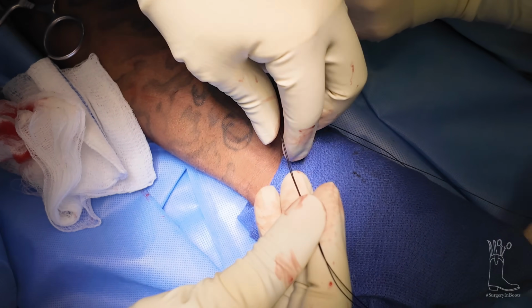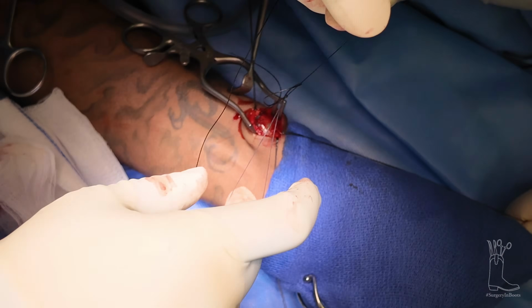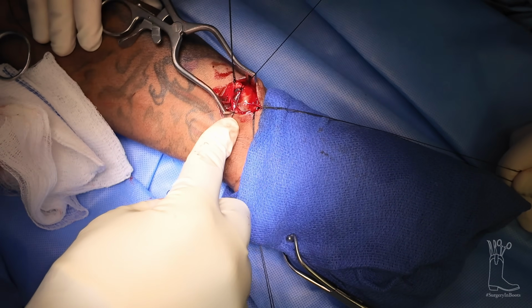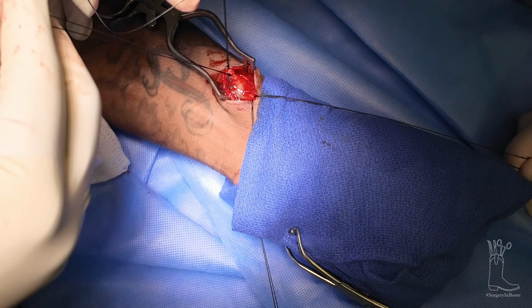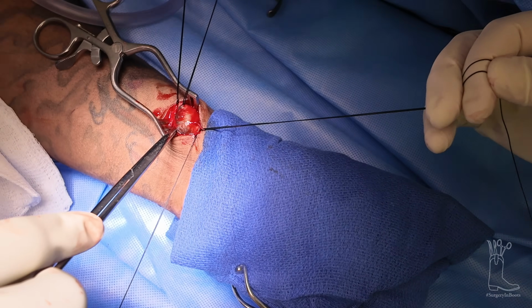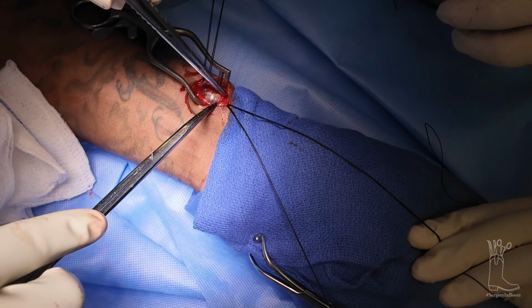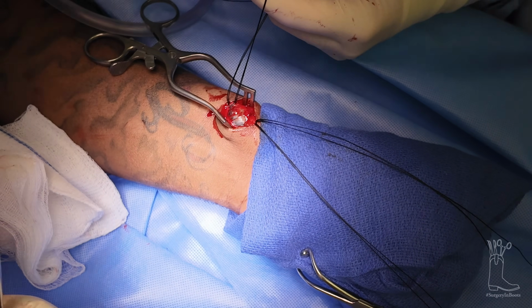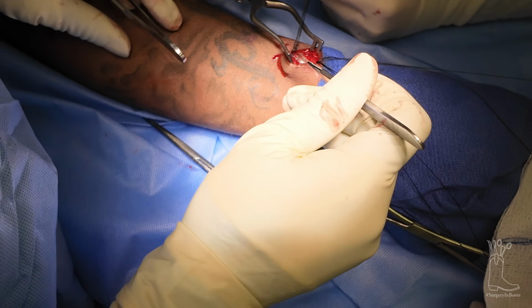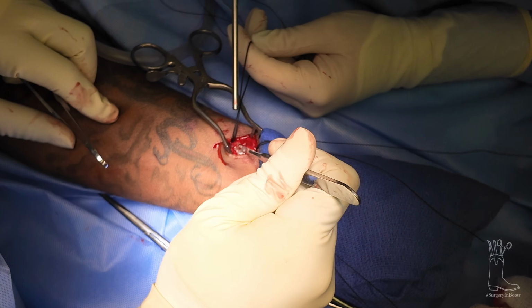Hold it. Good. I think this occurred because of some traumatic injury or something. Yep. So we tried that, didn't work. As weird as it sounds, you would think that what I would do is now just take this out, cut it. Yeah, you got a knife, please? So what we're gonna do is poke a little small hole in it. Get that suction ready, please. Just a little small hole.